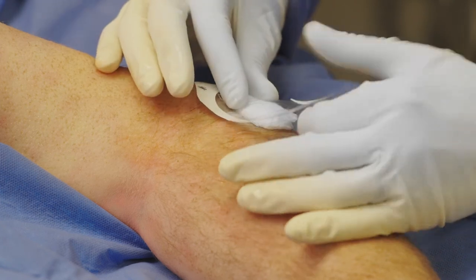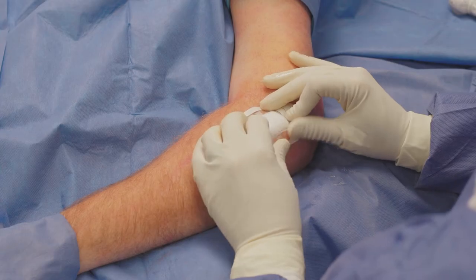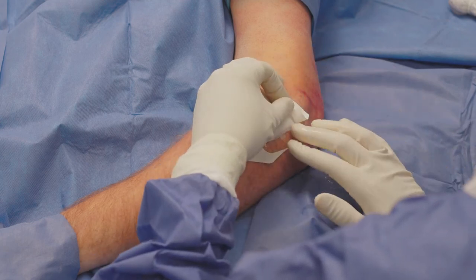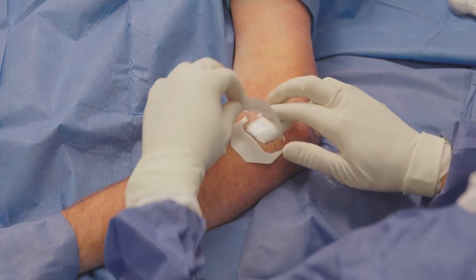Since the procedure is performed through a stab incision, there is no need for sutures. I place a steristrip and a small gauze bandage over the incision, which is then covered with Tegaderm.